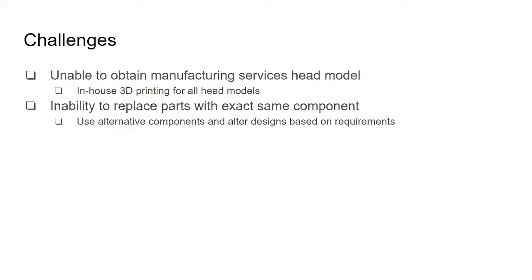Some anticipated challenges for this project are on the manufacturing side. If there is any issue with the manufacturing service not being able to meet my timeline or have an issue with producing our CAD models in the correct material, in-house 3D printing will be used to produce the head model. The trade-off will be that the model will not be transparent and won't be able to be made of silicone.